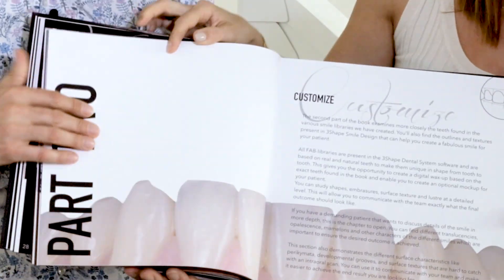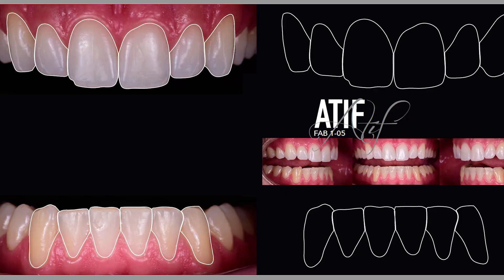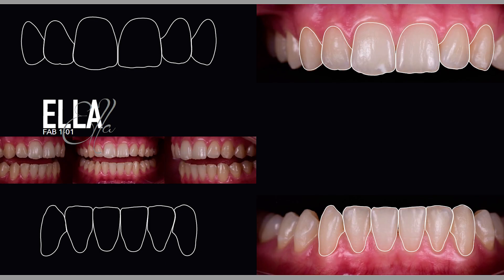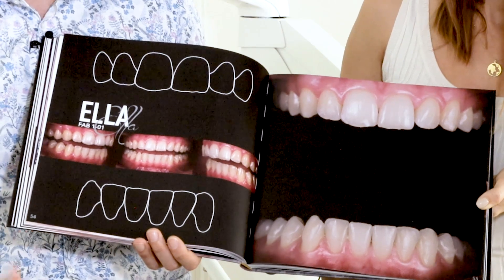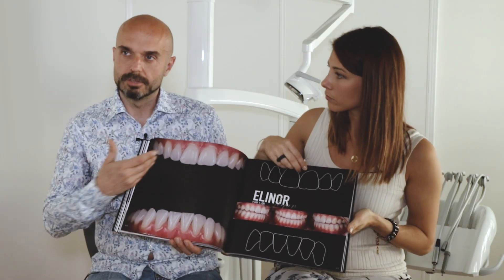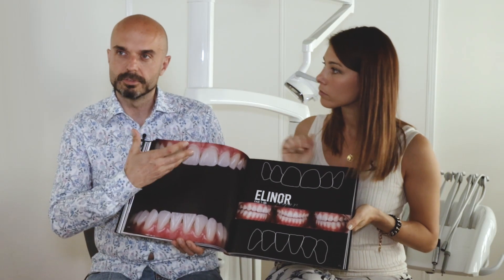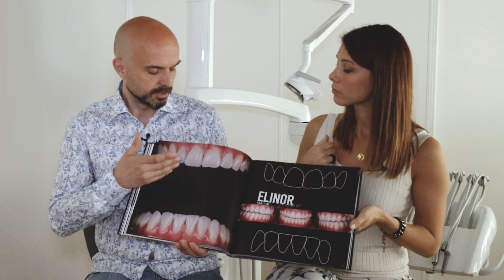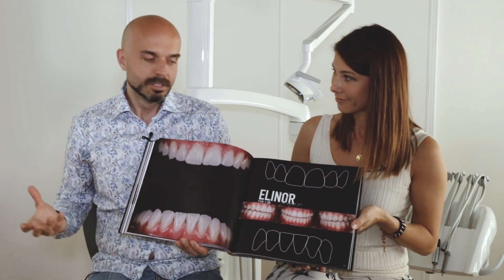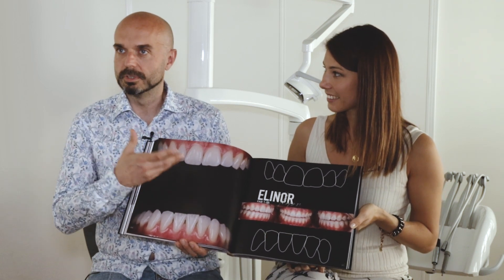Then we have part two, called Customize. This is more based on the communication between the clinic and the technician. We have a close-up for every smile, and you can see the surface structure, texture, and translucency on all the teeth. There are many different kinds of shapes, teeth, translucencies, and colorations, so dental technicians can get inspired.